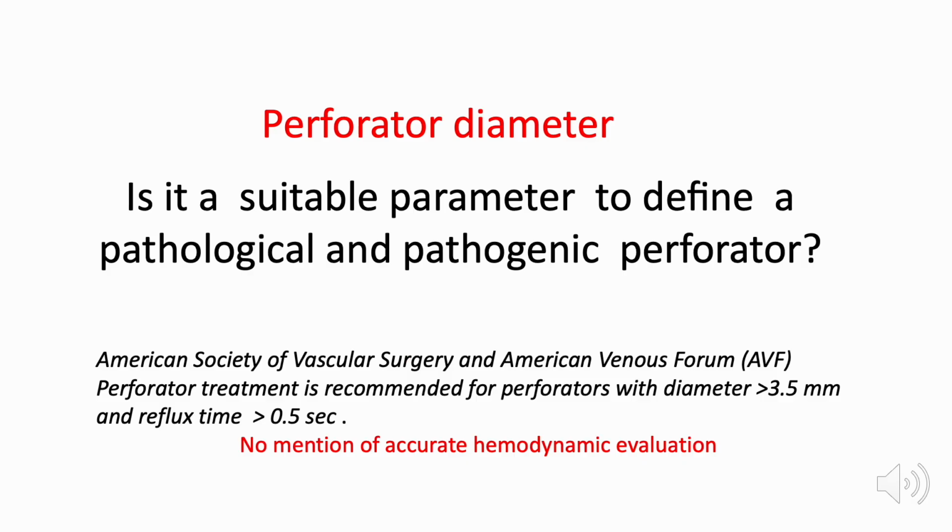And so, what about the diameter of a perforator? Is the geometric parameter widely considered in scientific papers to define a pathogenic perforator?